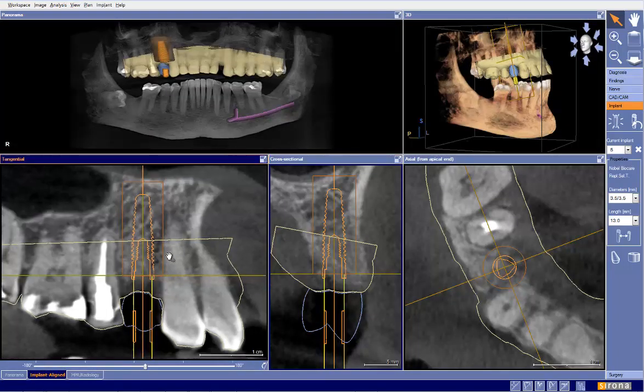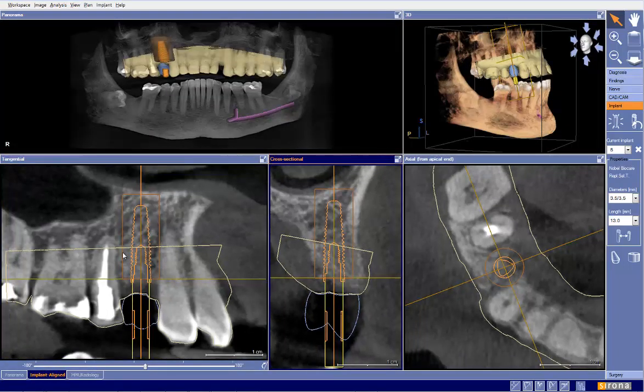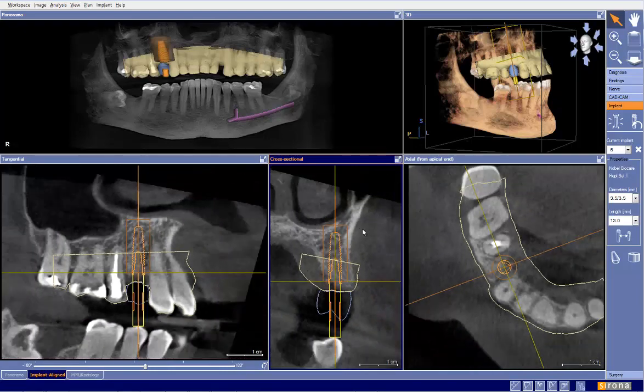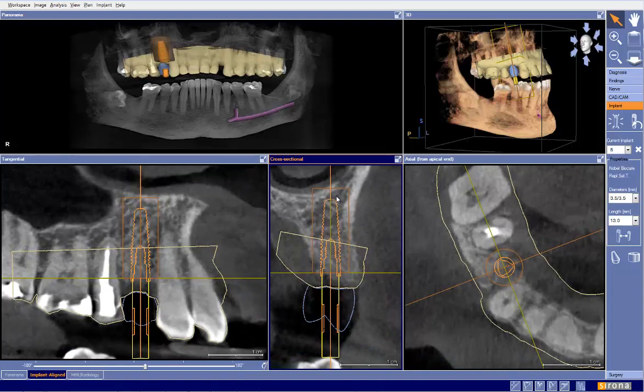Next, we'll look at vital structures. In this case, the vital structures will be adjacent teeth, the buccal plate, and the sinus. And we are totally good in all those directions. In fact, we're able to get a 13 millimeter implant in there.